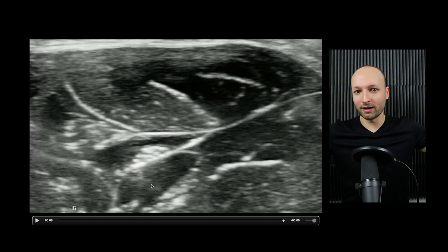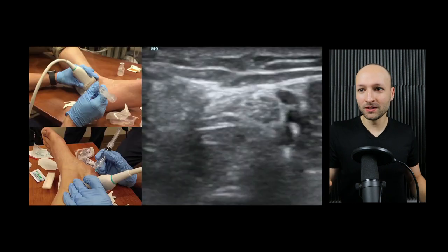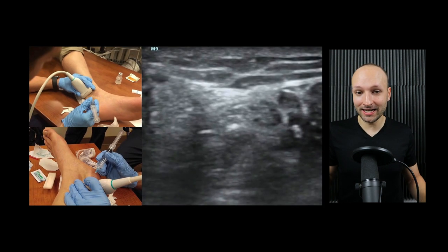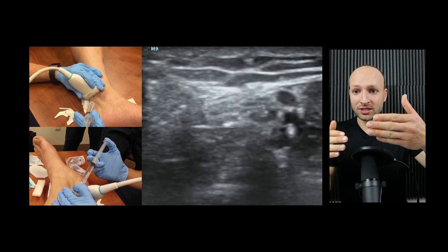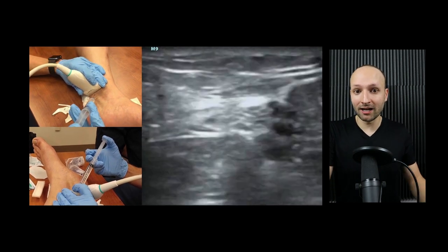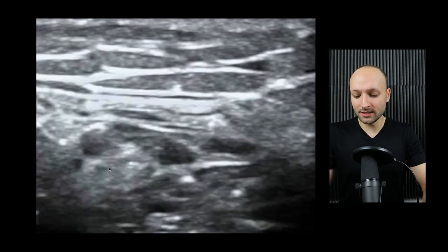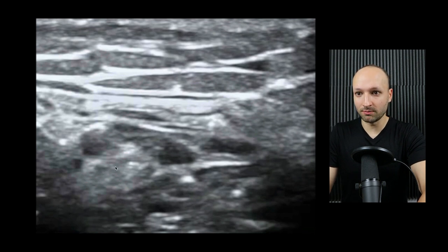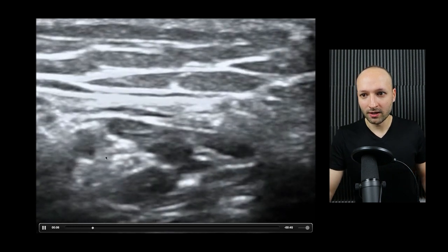With nerve blocks and any ultrasound procedure, I want 100% control. This is an out-of-plane technique. I usually do out-of-plane for median nerve blocks and posterior tibial blocks — which is what this is. You can see the transducer and needle are out-of-plane with each other. This is similar to doing ultrasound-guided IVs — you always have to make sure you know exactly where the needle tip is located. Here is a zoomed-in view of the posterior tibial block. This is the posterior tibial artery, and here is the nerve, with the needle tip putting the anesthetic all the way around that nerve.